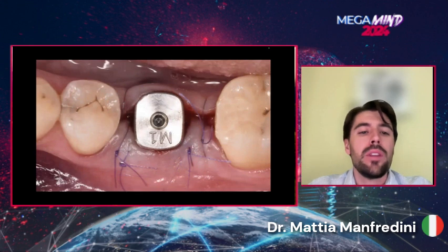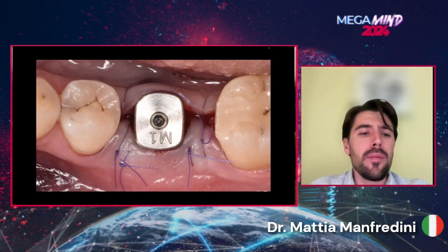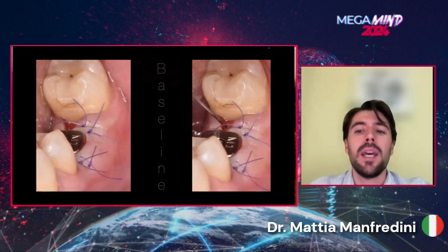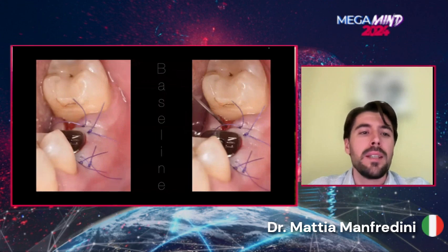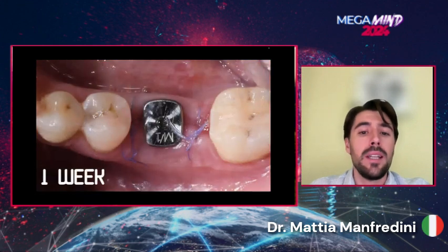It is then fixed to the primary flap with PGA 6-0 suture, and the same suture is used to close the flap, and it is already appreciable the volume gain through the graft and the anatomical healing abutment combined together. Hyaluronic acid, as shown in the picture on the right, can be injected in order to promote the healing in the secondary intention areas.